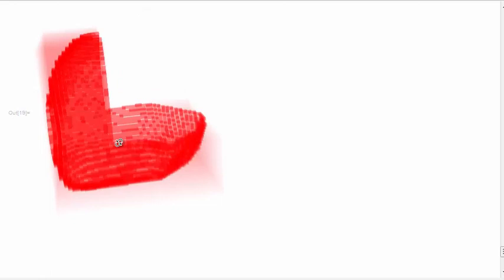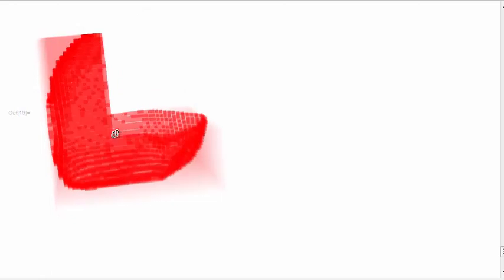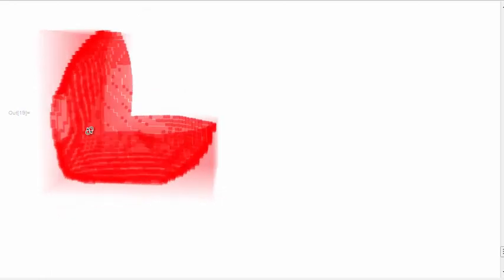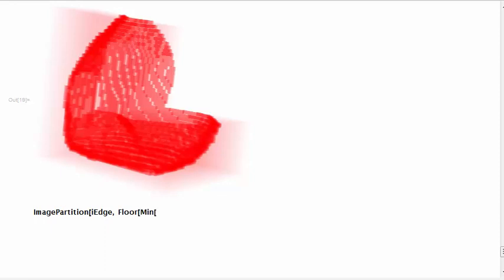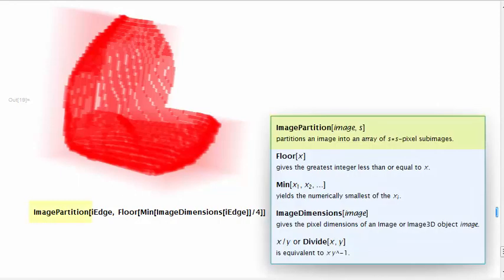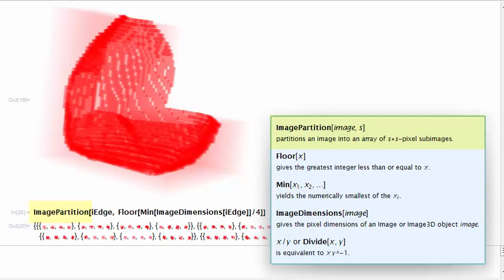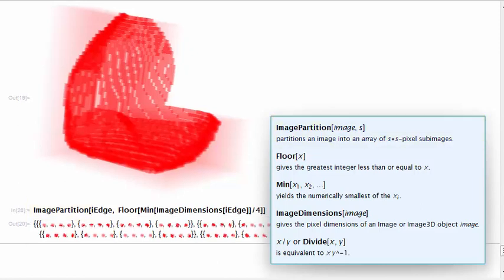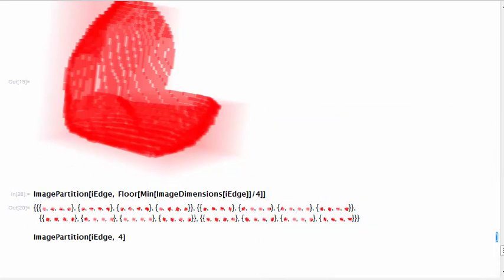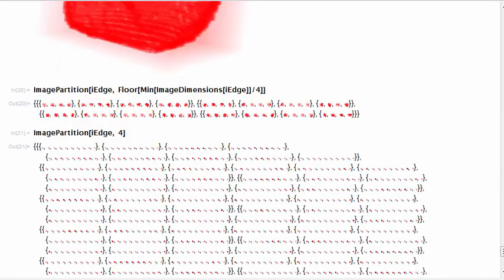To perform box counting, we need to divide this shell volume into cubes. We do this division using image partition that receives as first parameter the volume and as second parameter the size of the side of the dividing cube. Here I am illustrating the number of cubes that we get when using the max box size that we'll test on the algorithm.